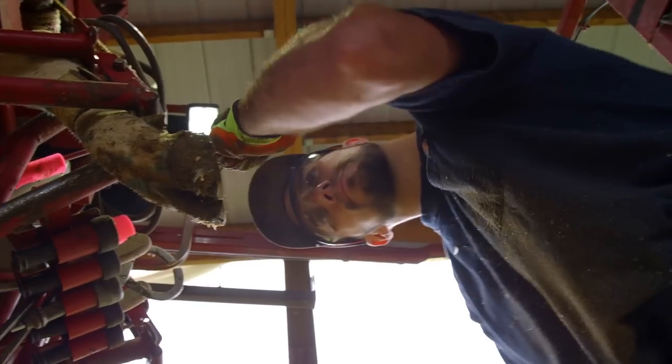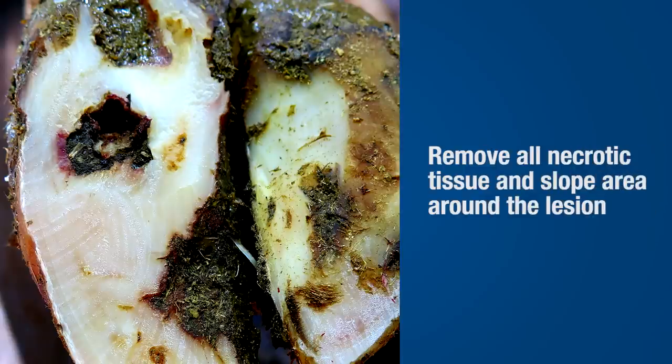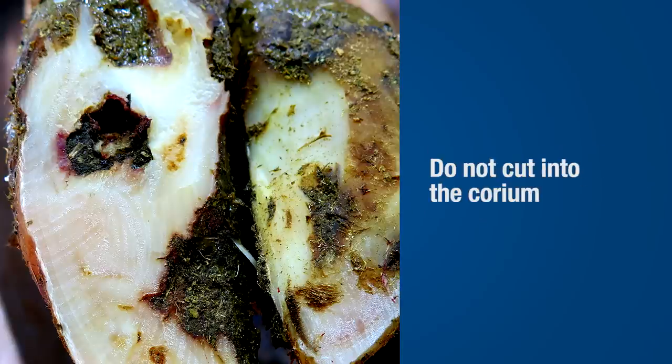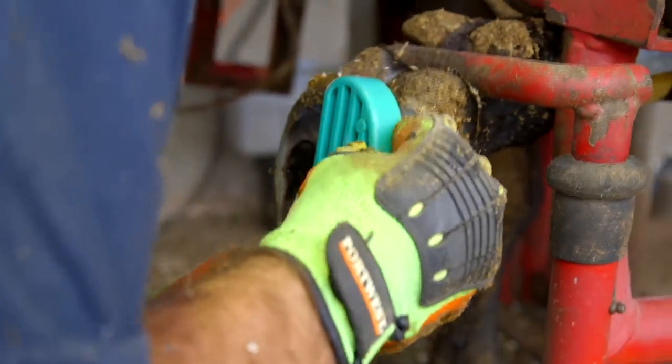Treating all lesions begins with a functional trim to restore claw length and balance, followed by therapeutic trimming. When a sole ulcer is identified, remove all necrotic tissue and slope the area around the lesion. Be careful not to create a hole where dirt and manure can lodge. When removing necrotic tissue around the lesion, take care not to cut into the corium beneath the horn. After all loose horn and necrotic tissue has been removed, apply a block to the healthy claw to relieve pressure and promote healing.